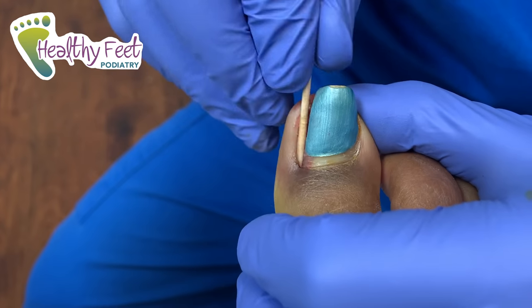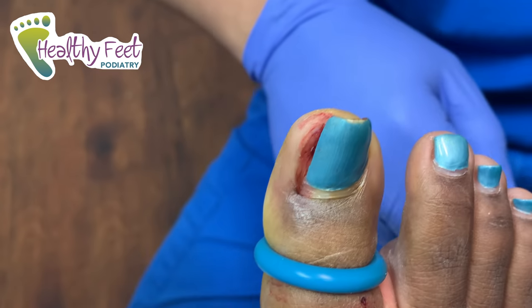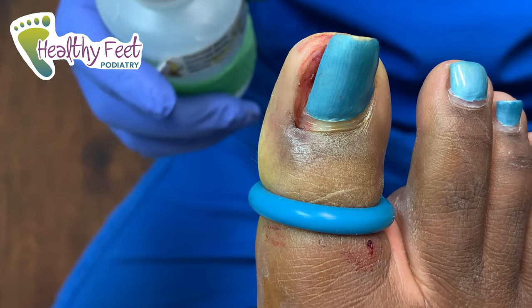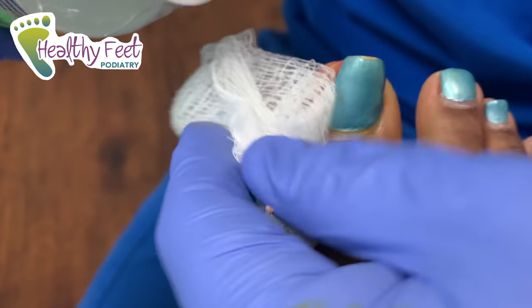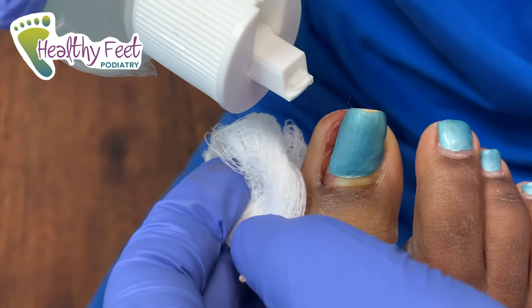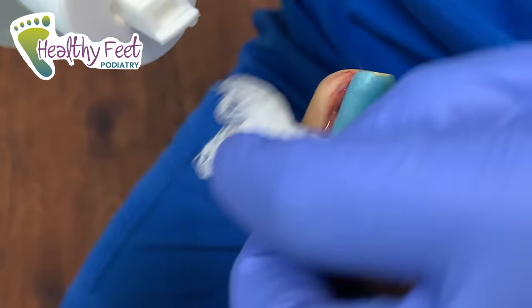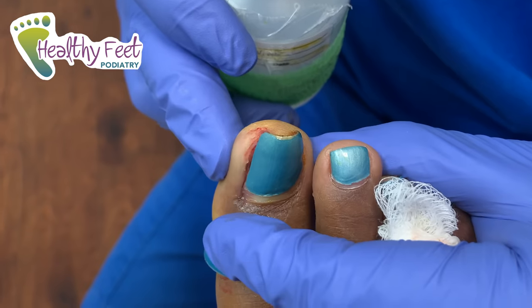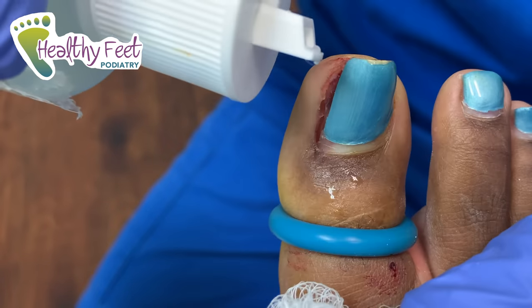So this is a little bit of sodium hydroxide — we're burning the root here. There are different ways of applying the medication. Some apply it three times, some apply it a little bit longer. I do it two times and a little bit shorter because I find that it still works just as well without causing any harmful side effects or complications. She's going to heal just fine. Look — toes still sexy. I'm bringing sexy back. Toes still looking good.